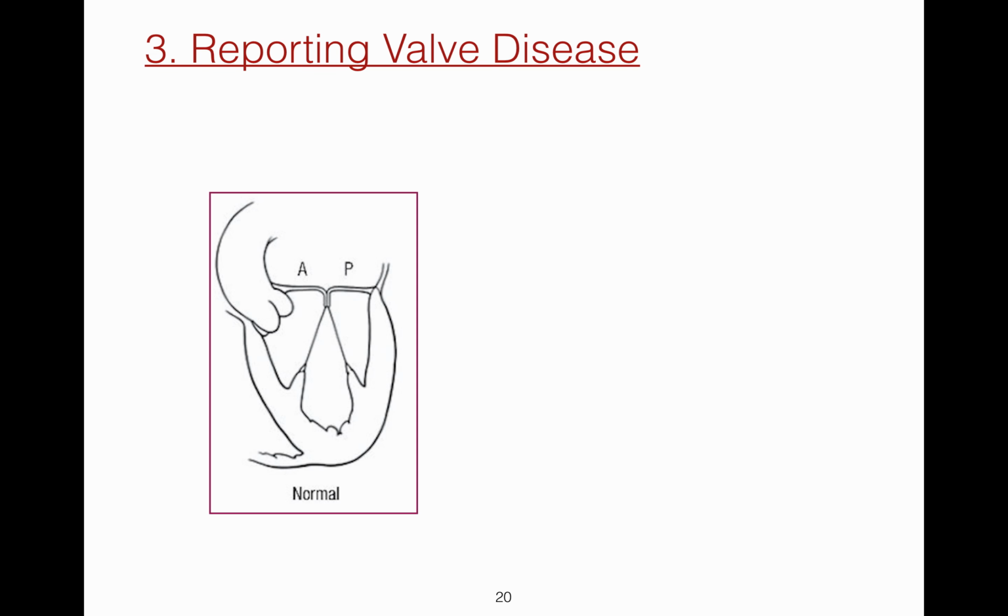When reporting mitral regurgitation, it's helpful to include a brief word about the direction of the mitral regurgitant jet, that is, whether it's central or eccentric.